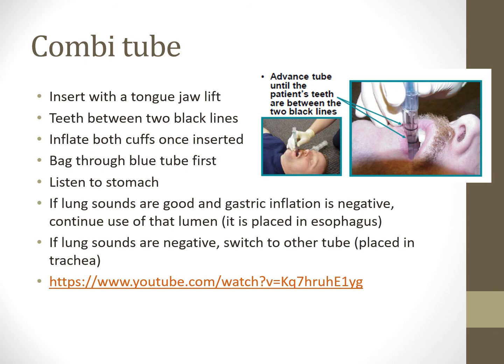So you're going to insert into the mouth with a jaw lift. You're going to inflate both of the cuffs when you do it. You're going to bag through the blue one first. Listen to the stomach. If the lung sounds are good and you don't have gastric sounds when you're listening, then you continue to use what you're using because it's not going to the stomach, right? And this means that it's placed into the esophagus, right? You occluded the esophagus, you occlude the oropharynx, and all the gas is going out of those little holes.